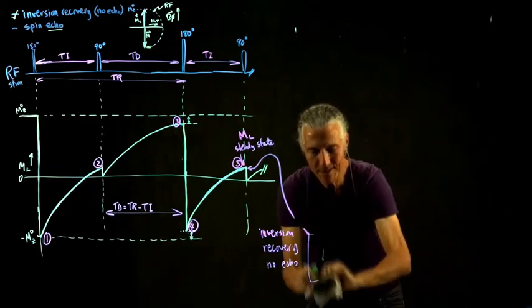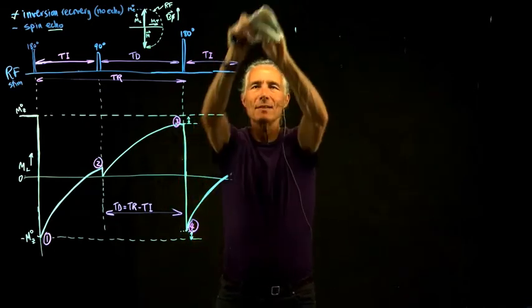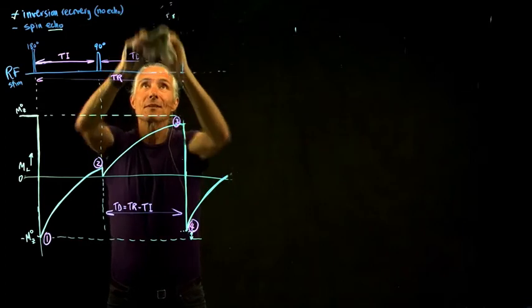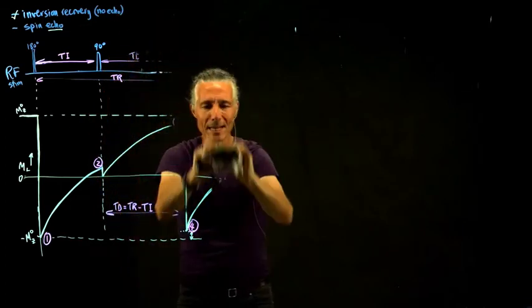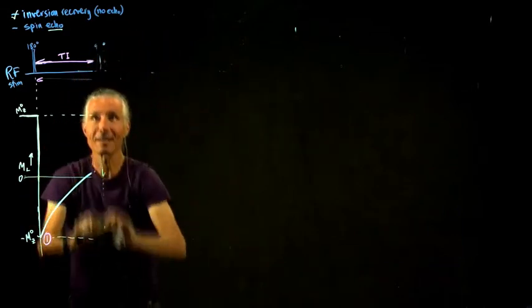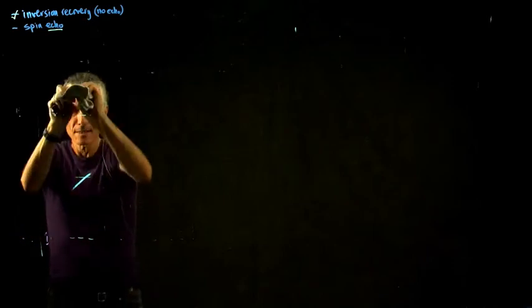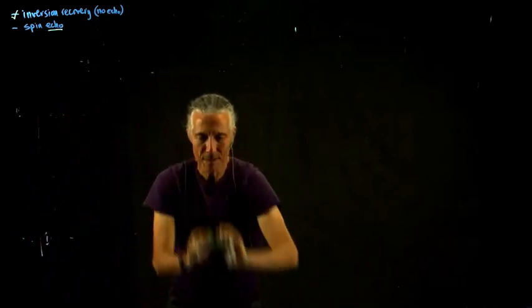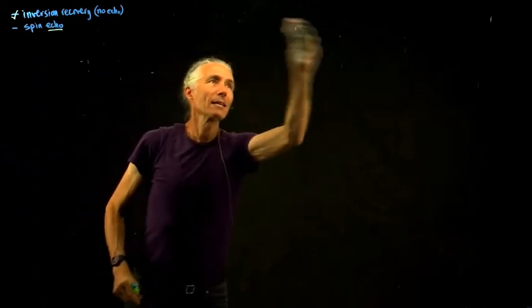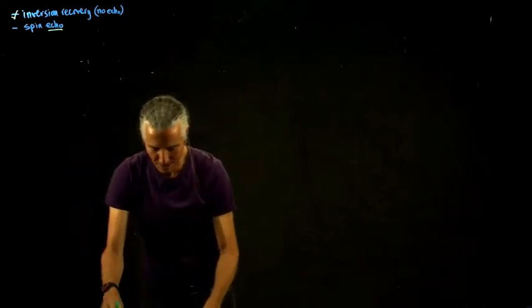So for this, I'm going to have to draw out more of a pulse sequence, which I haven't explained yet. But it's okay, we just take it on faith that this is what we're doing. There are some parts of what I'm going to draw out that I'm not going to explain yet, but we'll hopefully just focus on the parts that I am going to explain. So what we want is a very simple spin echo sequence. So this, instead of a 180 and a 90, is basically a 90 and a 180. So our spin echo sequence.